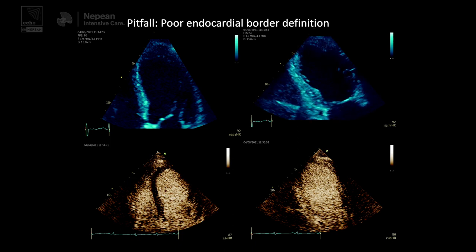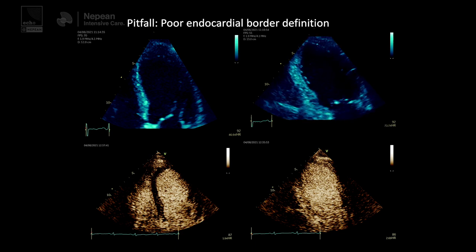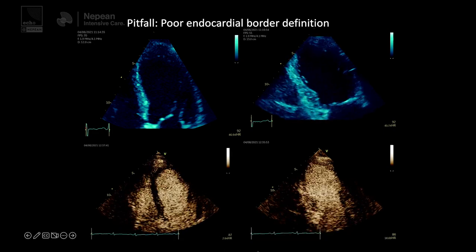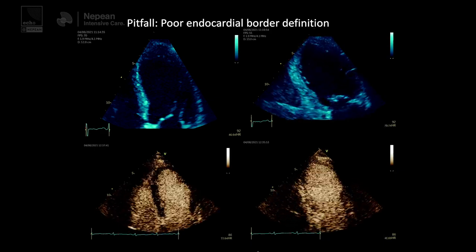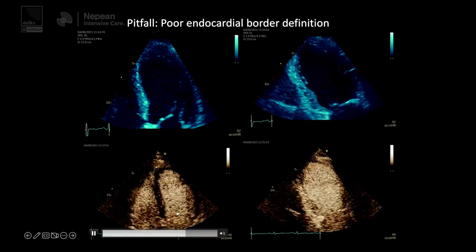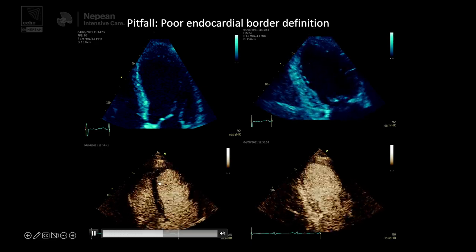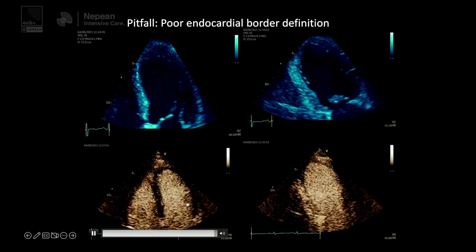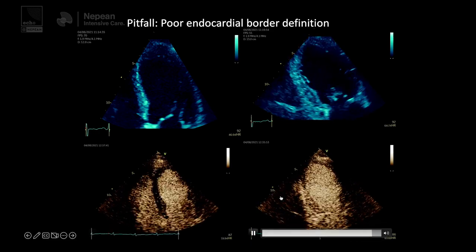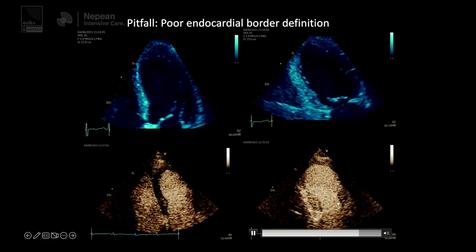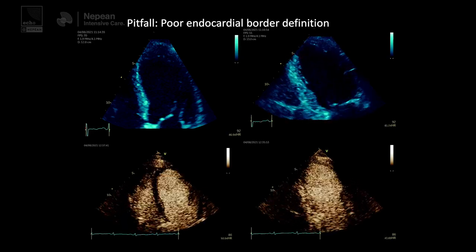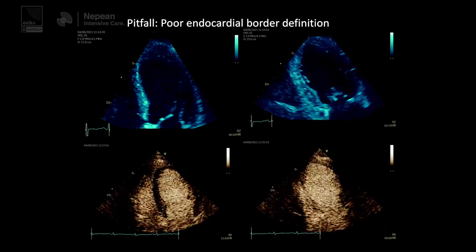It was really important for this patient's ongoing management. We wanted to establish whether this man had coronary ischemia or a Takotsubo-type pattern — obviously you need a coronary angiogram for that. What we did was give contrast — a left ventricular opacification study — and you can see how beautiful that tissue-blood interface is. You can see the little trabeculations and papillary muscle, all of which you need to include within the LV cavity. This one really has that Takotsubo look — the apical ballooning and basal sparing — which came to light beautifully when we gave contrast.